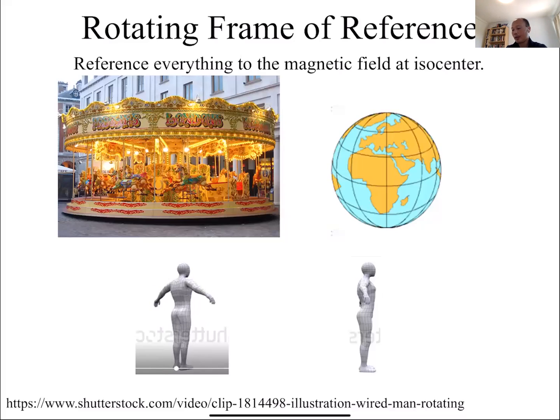If we imagine the spins precessing at the Larmor frequency, they might be precessing around like that, but at isocenter, we imagine that spin will just be steady like that. So once again, at z equals 0, any spin at isocenter, for the purpose of this class, is always going to stay at theta equals 0.